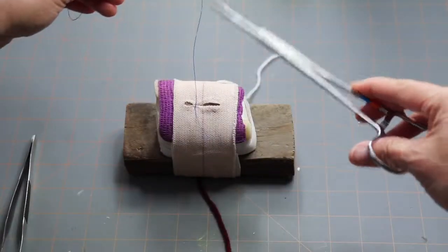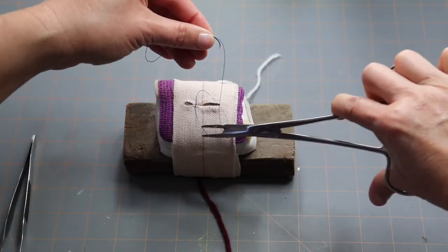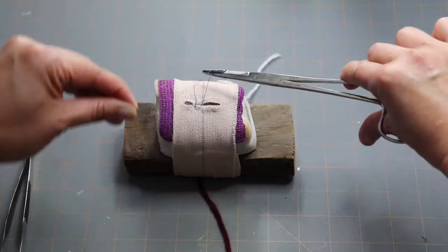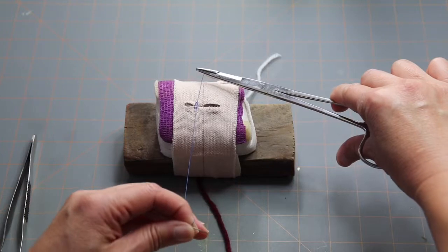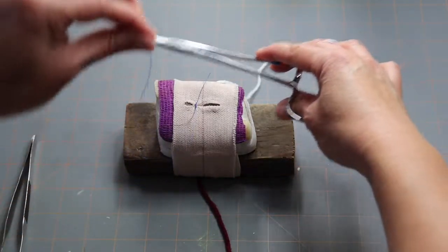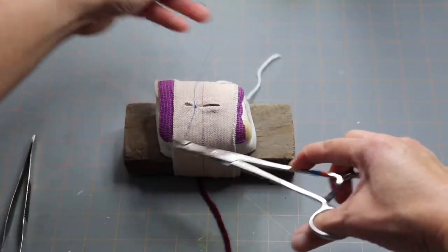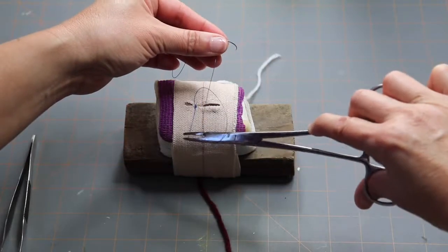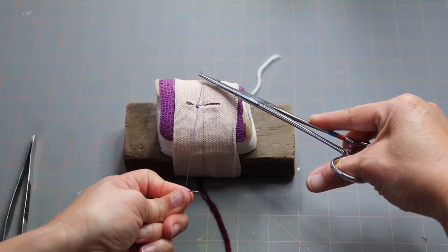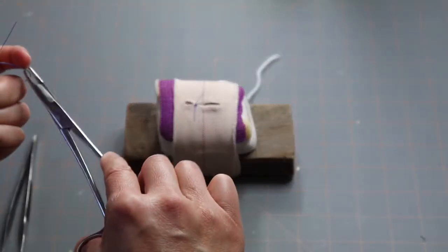Throw number two: keep your needle holder in the middle over your incision, wrap your suture over and around once, grab the edge of the suture with your needle holders, and move hands in opposite directions — left hand toward you, right hand away from you. Make sure your knot is flat, pulling equally on both sides. Pull nice and tight. Throw number three: wrap around, grab the end, pull through. Throw number four: wrap around once, grab your suture, move hands in opposite directions, pull through equally, parallel to your patient. Now we're done with our knot. Pull both ends up and cut them at the same time. There is your simple interrupted suture number one.